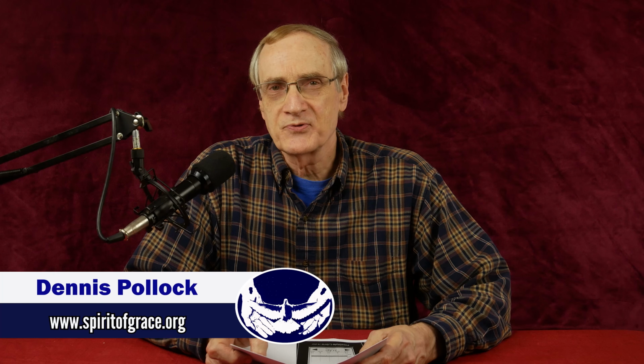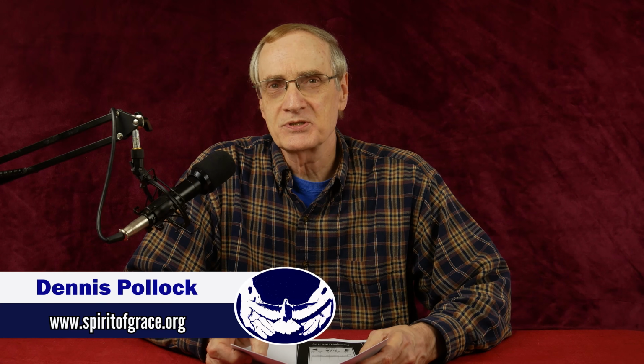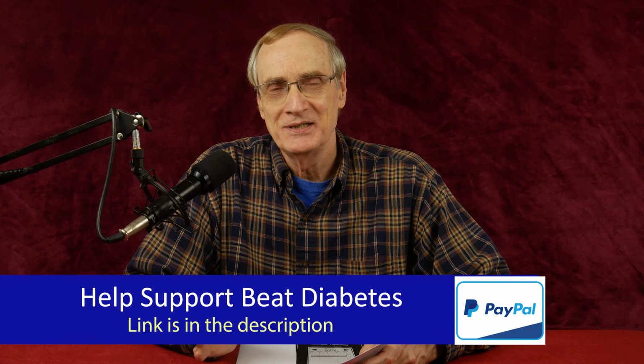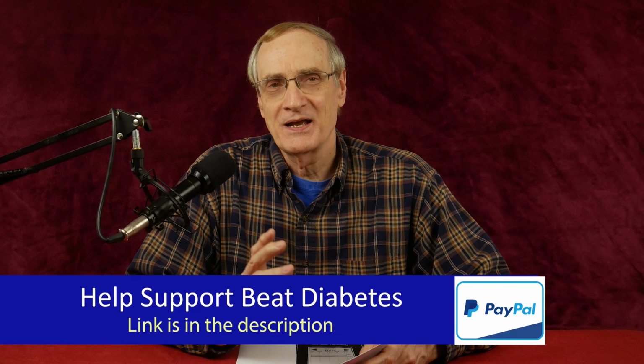Recently, I used the Freestyle Libre continuous glucose monitor for 2 weeks. I purchased one scanner and one sensor, and I used it for the 14 days before that sensor expired. And not only did I get interesting and good results in terms of scanning it, but also that thing is recording your glucose when you're not even aware of it. Every 15 minutes, it's taking another record of your glucose levels.